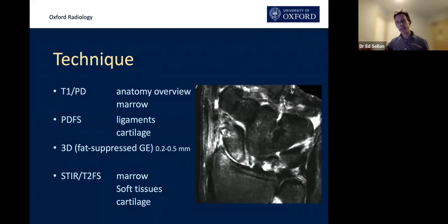What's the problem with 3T? There isn't really much problem except competition on the scanner — and 3T is actually faster, producing less movement artefacts. The problem is susceptibility artefacts. If you have a post-operative patient with metalwork, or even just some prior instrumentation, tiny invisible bits of metal can produce artefacts. If you've intervened on a patient, it's not always the right thing to do a 3T scan.